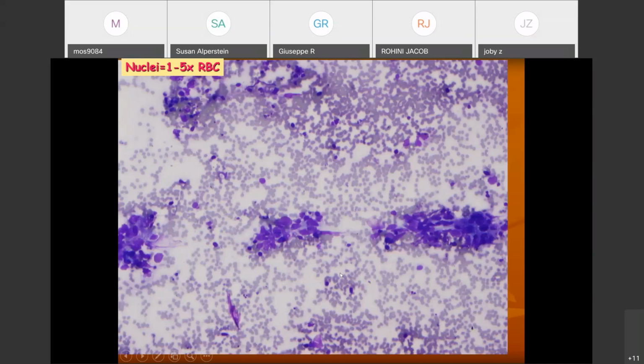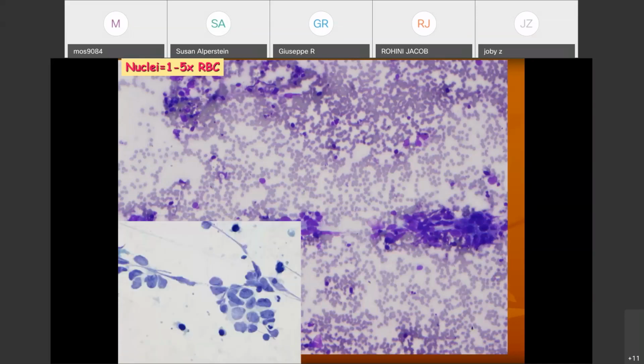And then you have nuclear. How do I stop this? I don't want to use it. If you go there, it's close to it, it comes up. If you move away, it should go away. Okay.